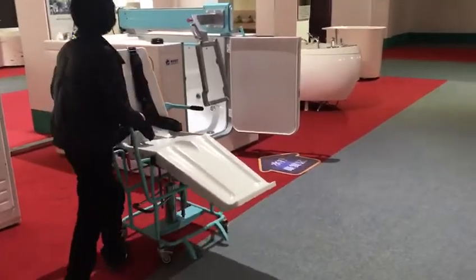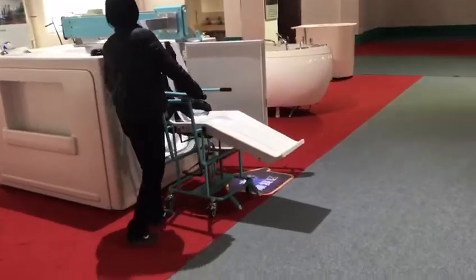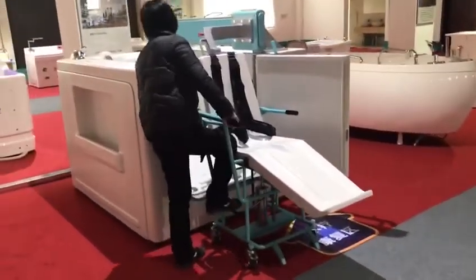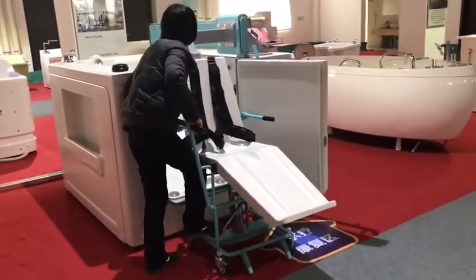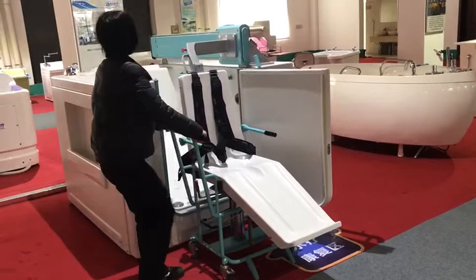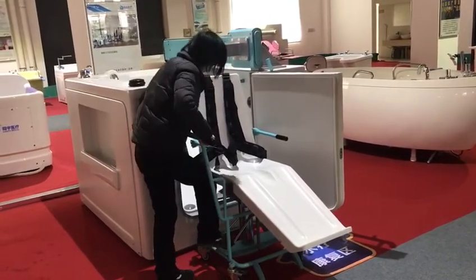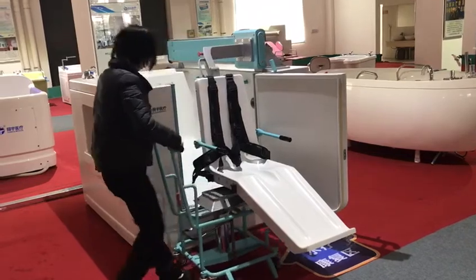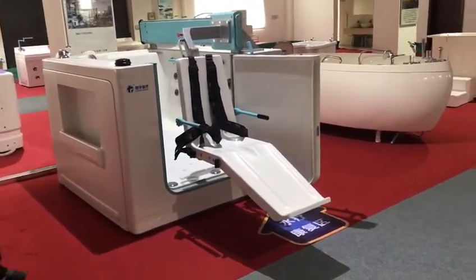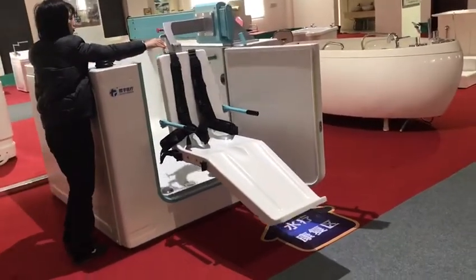Firstly, we need the trolley to transfer the patient — it's very easy and convenient to control. Move and pull out the trolley, and now we need to pull the patient to the bathtub.